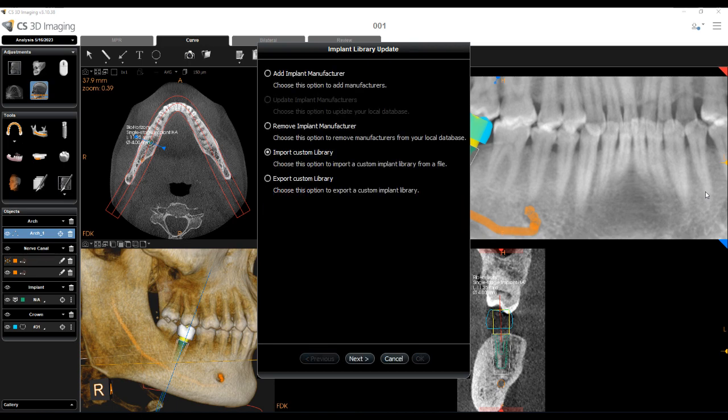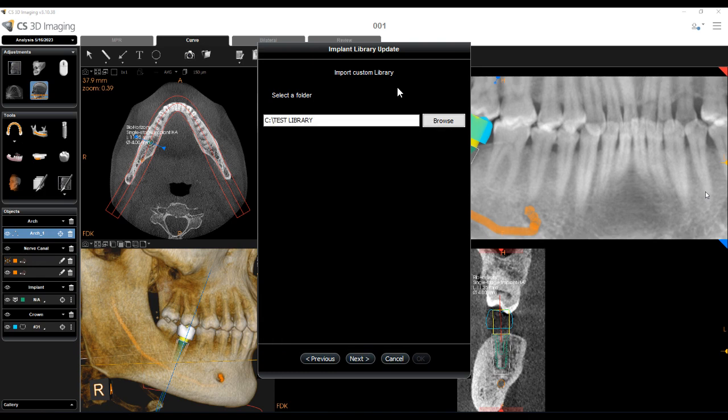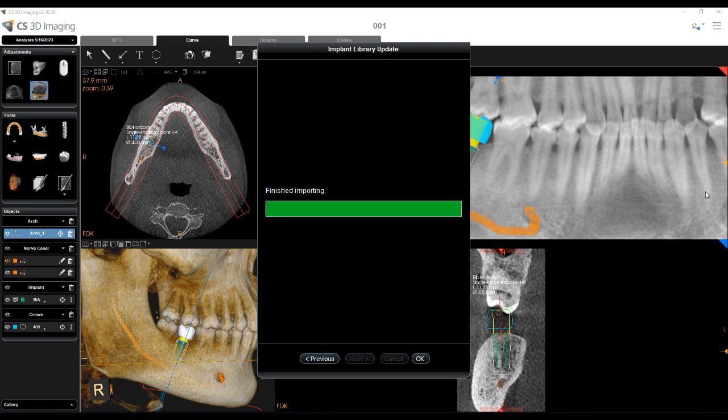To import a custom library, select Import Custom Library and click Next. Click Browse and select the folder with the custom library zip file to import. Click Next. The file is imported. Click OK to finish, or Previous to return to the Options menu.